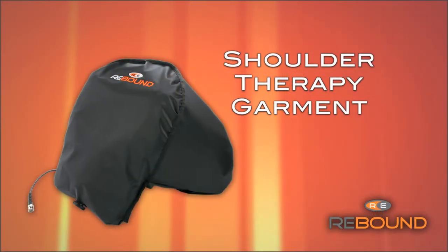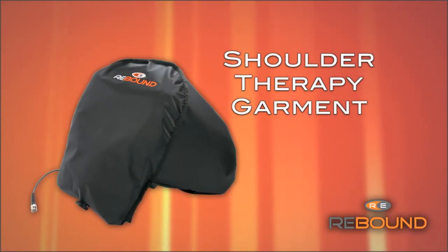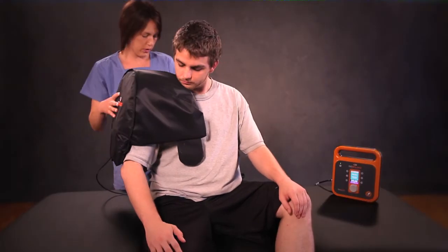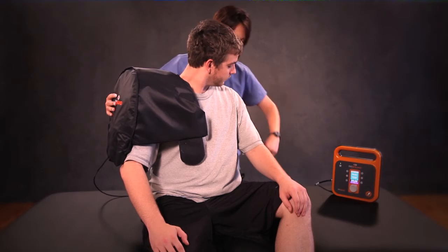Shoulder therapy garment — this is a one size fits all garment used for both the right and left shoulder. To use, place the garment on the patient's shoulder, then attach the velcro underneath the opposite shoulder. This does not need to be tight, just secure.